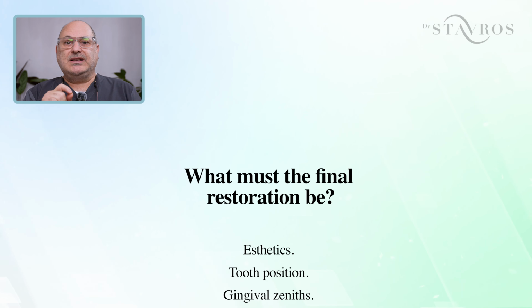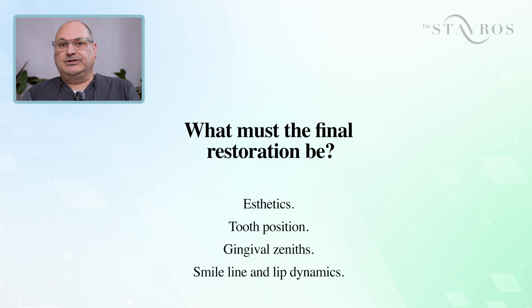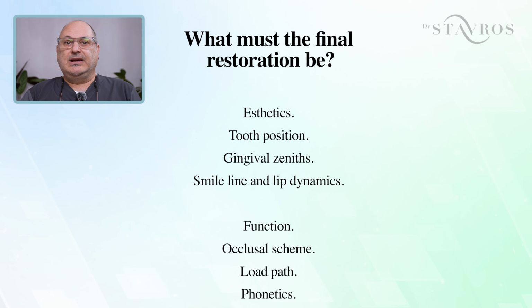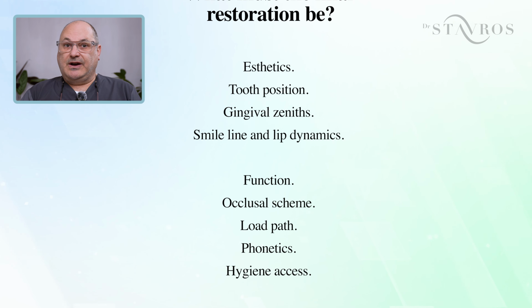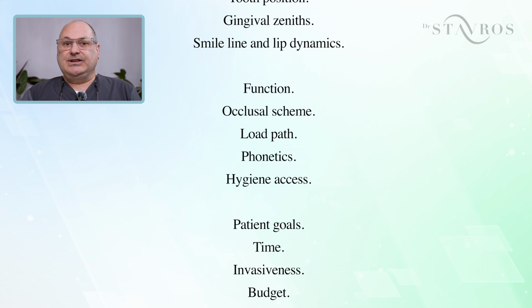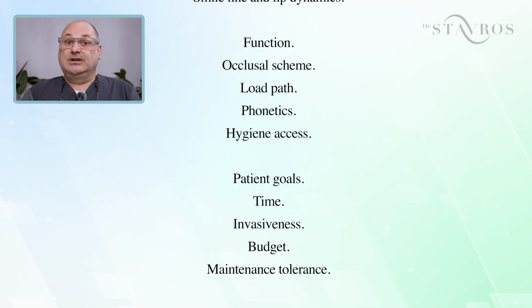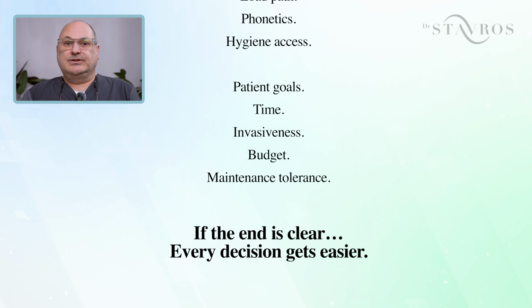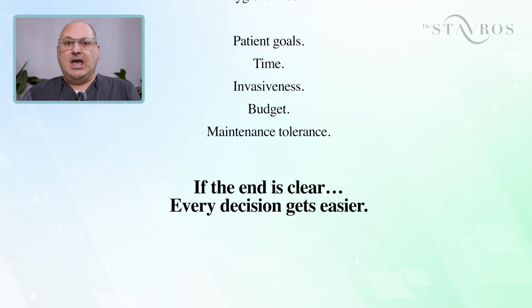So we start with the result. Before scans, before implants, ask one question. What must the final restoration be? So we have to take into account aesthetics, tooth position, gingival zeniths, smile line, and lip dynamics, function, occlusal scheme, load path, phonetics, hygiene access, patient goals, time, invasiveness, budget, maintenance tolerance, and the end is clear. Every decision gets easier.